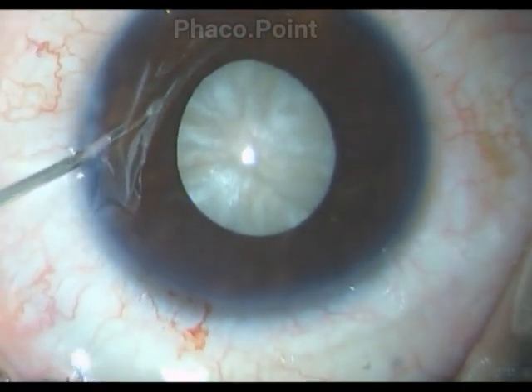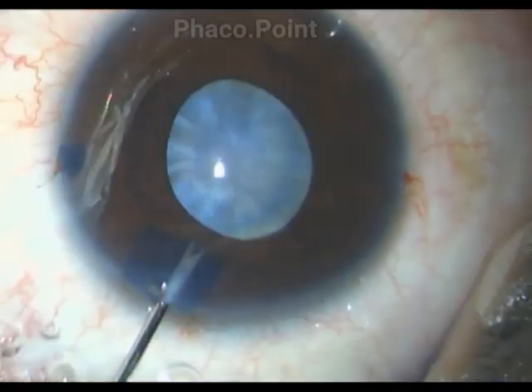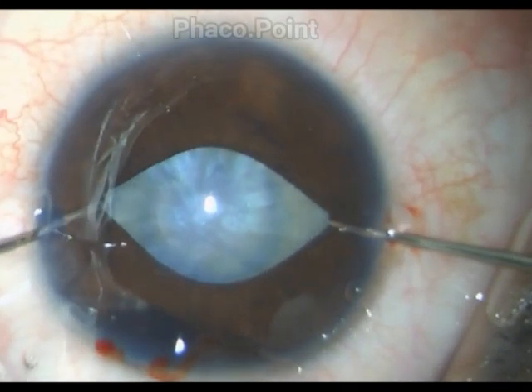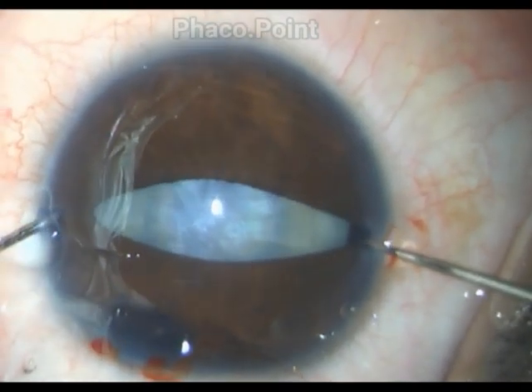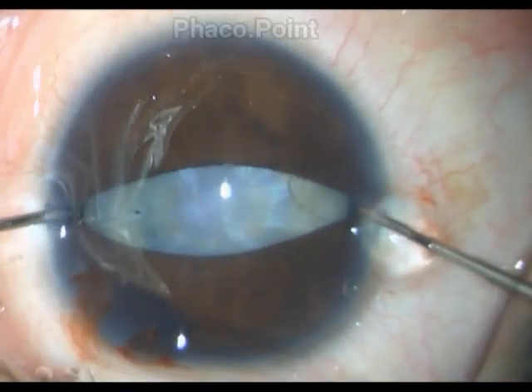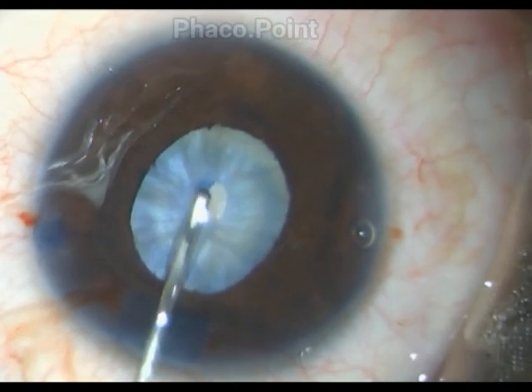Take your time to evenly stain the anterior capsule — it's very important to do so to aid your visibility in getting it right. After which, you need to deepen the chamber with a heavy-duty cohesive viscoelastic, which gives you the flattening of the anterior capsule. The pupil is then being stretched with a stretched pupilloplasty.